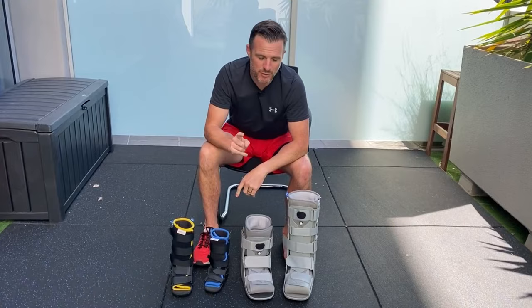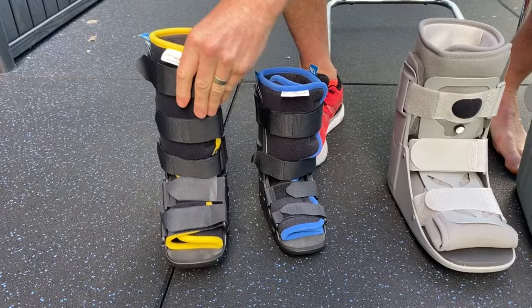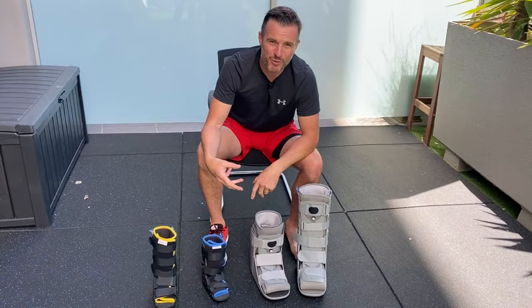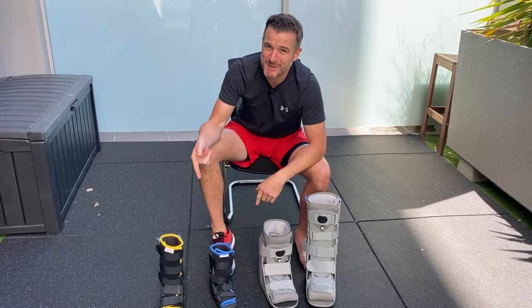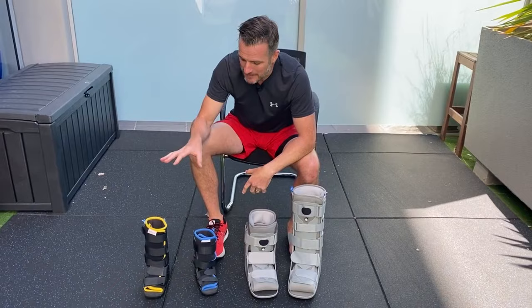These smaller ones are pediatric boots for kids. You'll notice they don't have an air pump. They're for kids with minor fractures in the lower leg or bad ankle sprains that just need to be immobilized. Kids tend to run on ankle sprains, so a boot is great — they don't need to be in it for too long. It's also a good alternative to a plastic cast for slight or foot fractures.